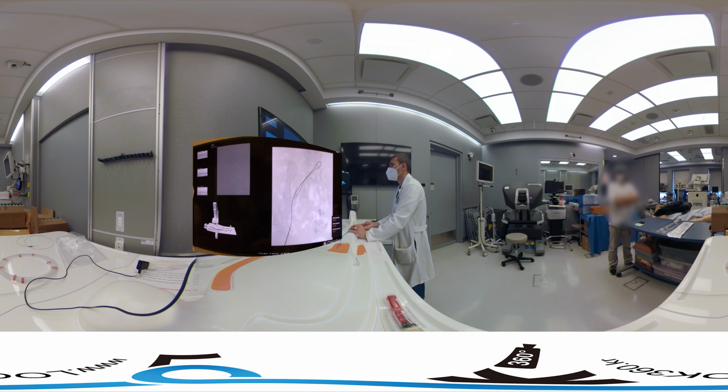Let's see what we're in right now. Let's do a little injection here. We're going to pull our wire back and do a little injection. And note, we can see that we're in a branch that goes down to the lateral aspect of the pelvis. So that's not what we want. So let's see if we can find something else. It's more fitting with the uterine. Let's see.